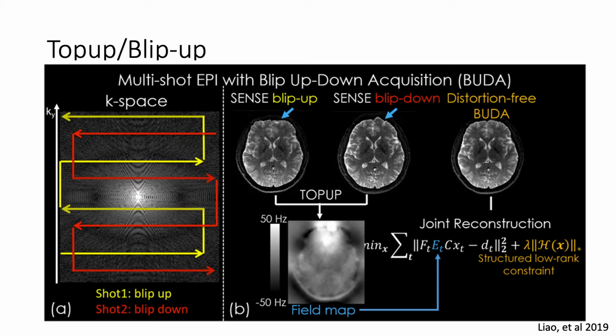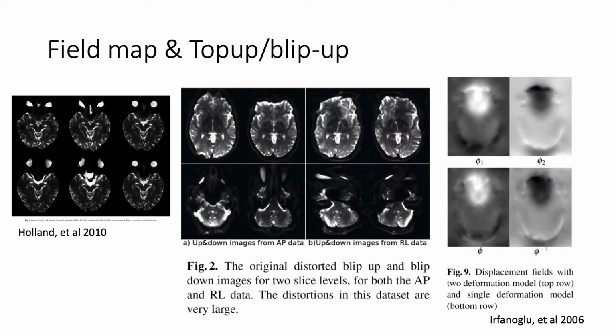In this case, would you just know if it fixed it if it looked like the alignment between the functional and the anatomical was not warped, like overlaying those? I don't know if that would be the best way, but it should. The warping will be better if you pick up this signal in your EPI, and I'm trying to see if I have a slide here that really captures the difference.